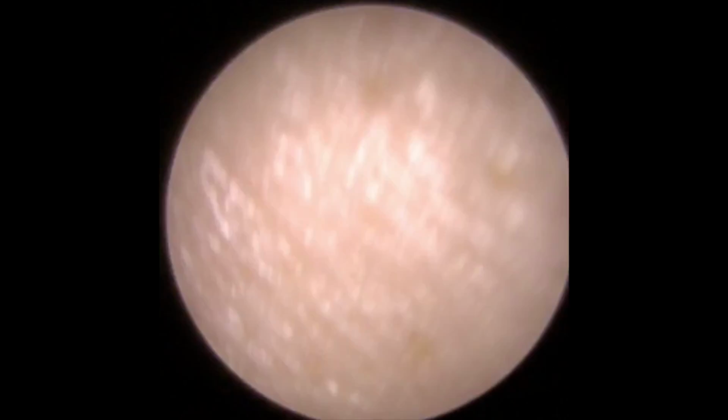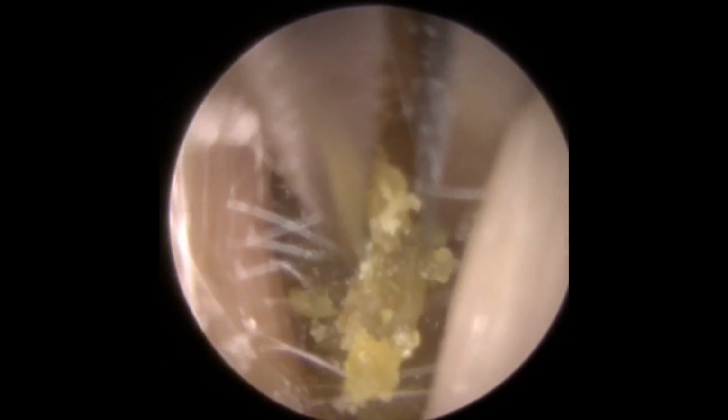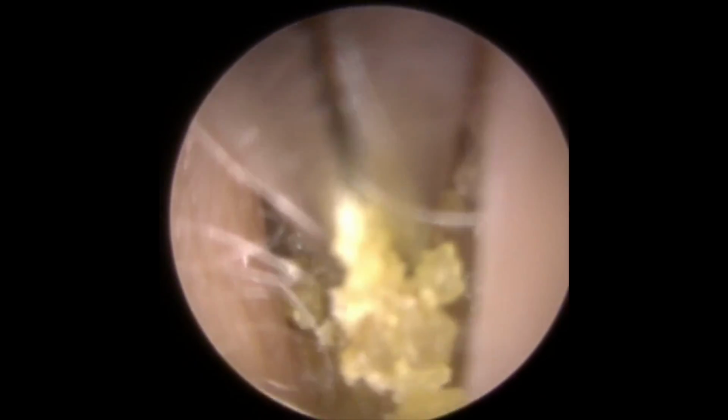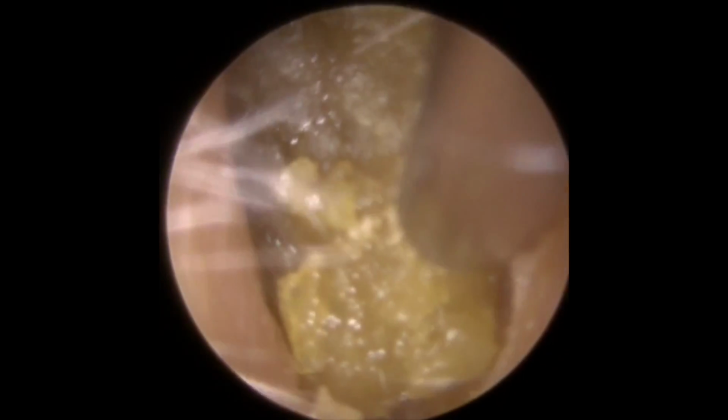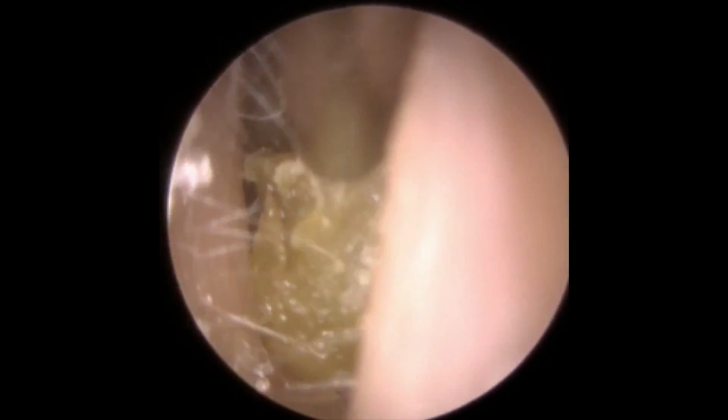And what you tend to find is, as you can see there, because it's narrow and then widens at the back end, when you try and push the forceps either side to get a good grip, the ends of the forceps inadvertently touch the wider section of the back and push it further in. So then you've got to work really hard to get it back to the front of the canal again. So what I've decided to do is just mash up the front end of this wax, break it down a little bit, and then we'll go in and remove that. Because it is quite hard, the forceps are good at breaking harder wax down. This allows me then to use the suction to break some more pieces away, which is hopefully going to make it small enough to work its way out. You can see we've got a nice flat section there now.